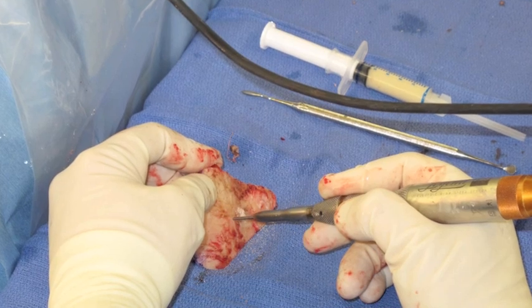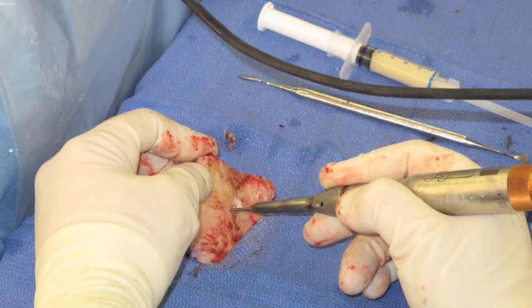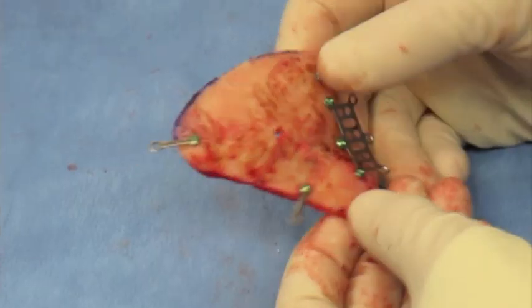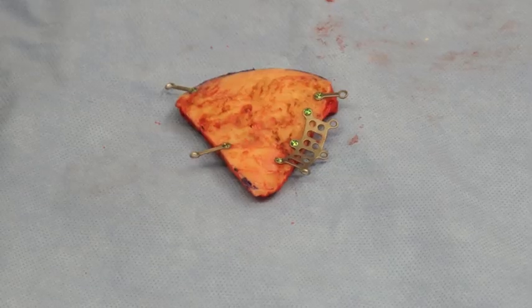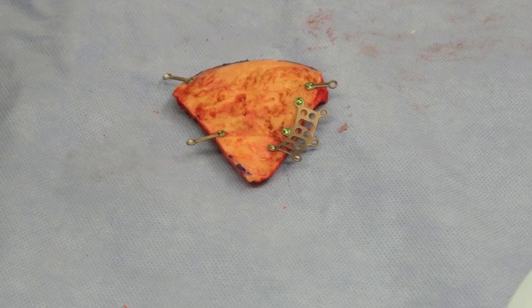The bone flap may be reattached in numerous ways at the conclusion of the operation. Our preference is to use metallic implants with a small link placed over the keyhole, a gap plate over the sphenoid wing defect, and two long links posteriorly to obtain solid three-point fixation.